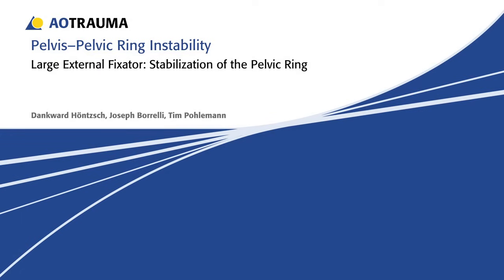Injuries to the pelvic ring can be life-threatening and require immediate stabilization. In this presentation, the techniques for stabilizing the pelvic ring with the external fixator will be demonstrated.